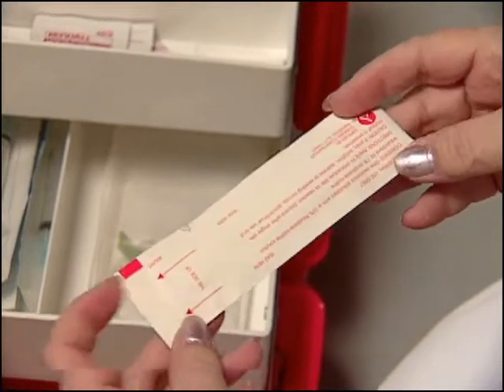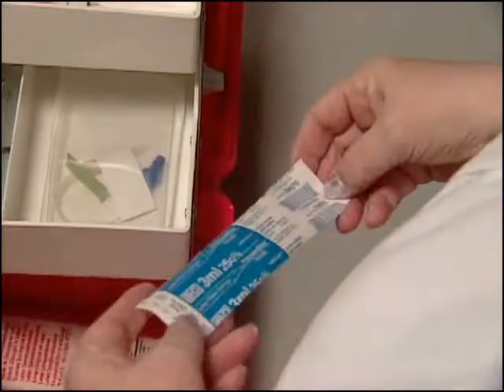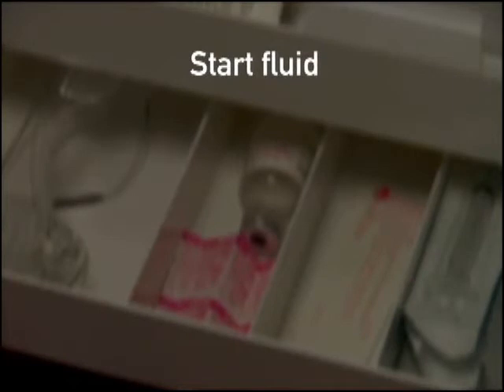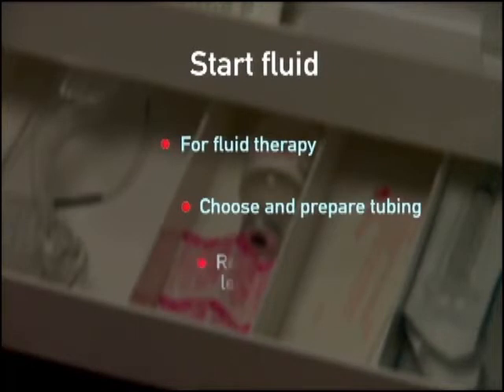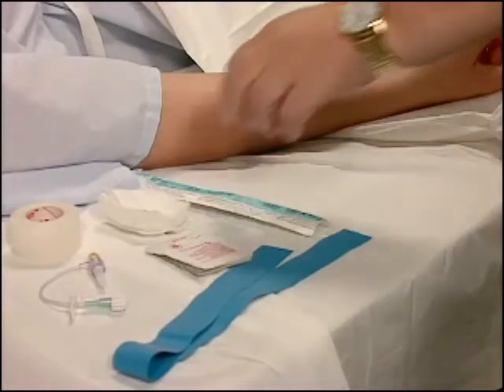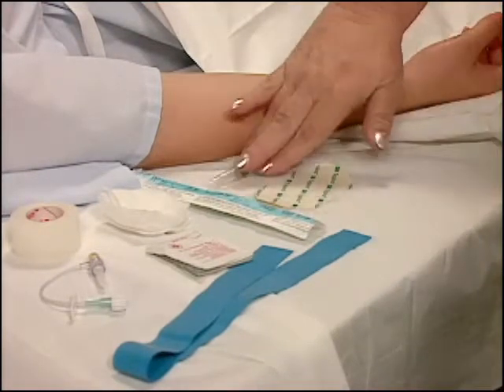If the patient is to receive fluid therapy, choose and prepare a bag of fluid with tubing prior to inserting the catheter. Check packages to ensure sterility. Pay special attention to packages of fluids. Check the expiration dates and examine the packages carefully to determine if there is any contamination of the fluid by foreign bodies. Before inserting the catheter into the vein, ready your equipment for securing the catheter.